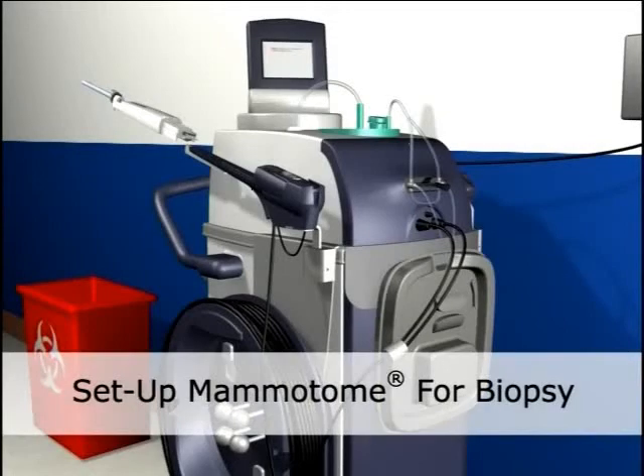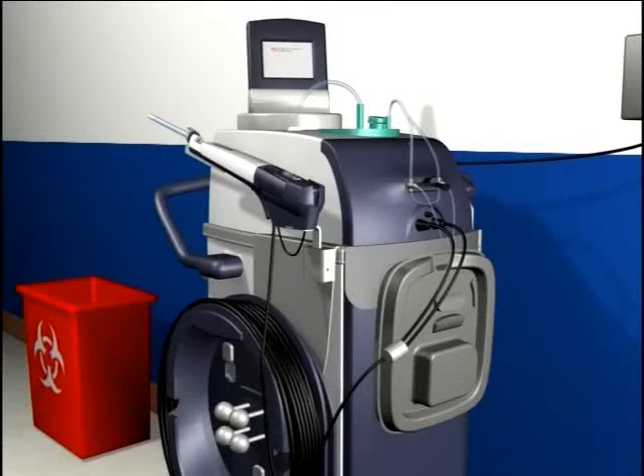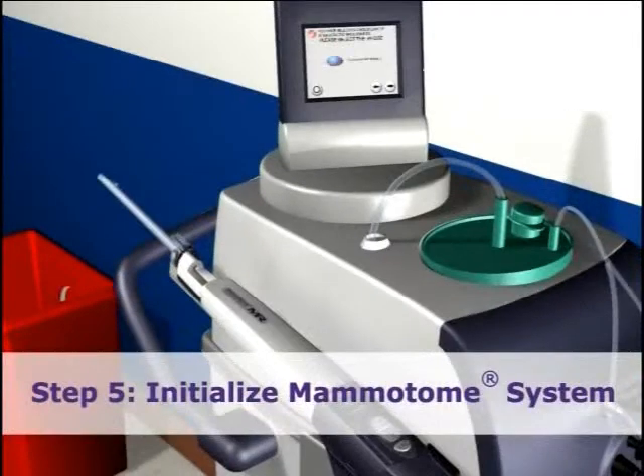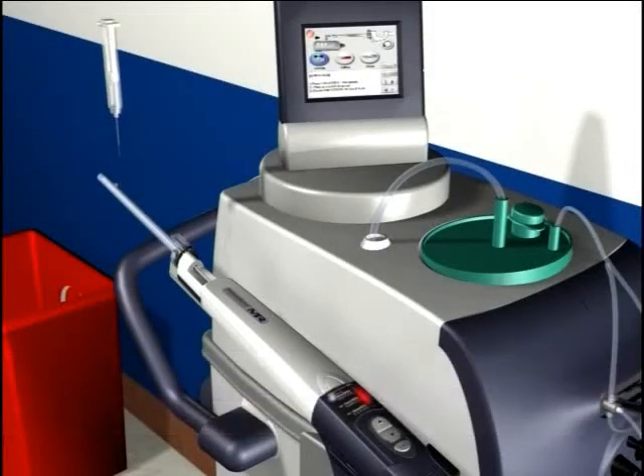It is now time to initialize the Mammatome system. Start by inserting the probe into the holster. Attach the tubing to the side of the probe from the front of the cart. Turn on the Mammatome system. Inject saline into the aperture of the probe to prime the system and ensure the vacuum is working.